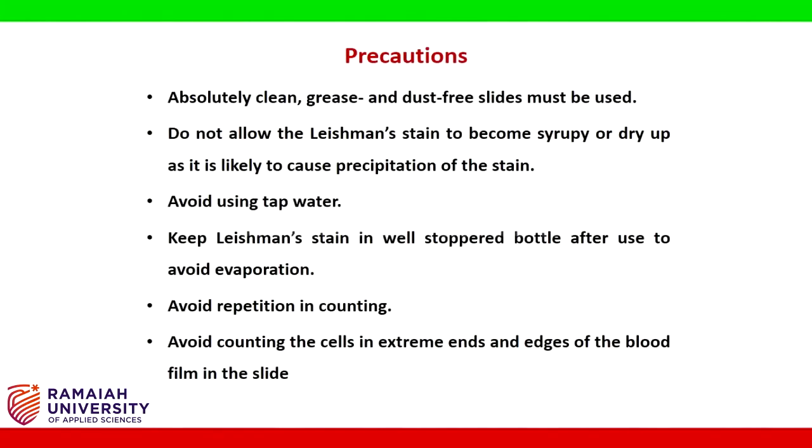Precautions: absolutely clean, grease and dust free slides must be used. Do not allow the Leishman stain to become syrupy or dry up, as it is likely to cause precipitation of the stain. Avoid using tap water. Keep Leishman stain in a well stoppered bottle after use to avoid evaporation. Avoid repetition in counting. Avoid counting the cells in extreme ends and edges of the blood film in the slide.